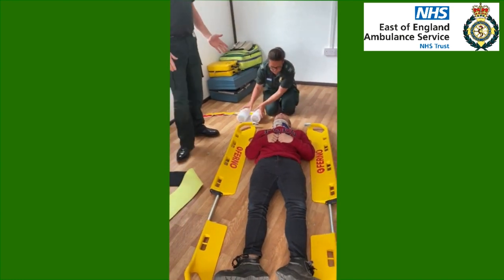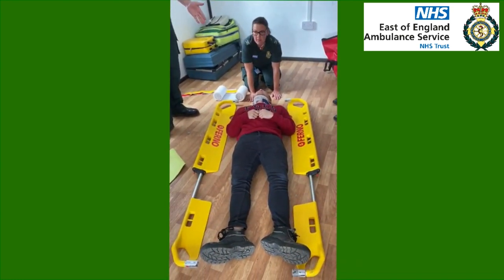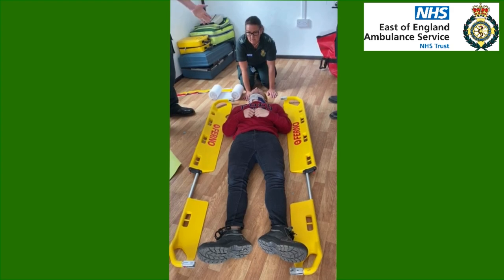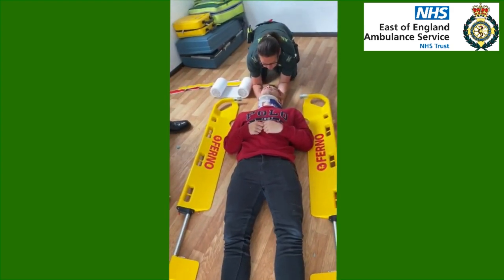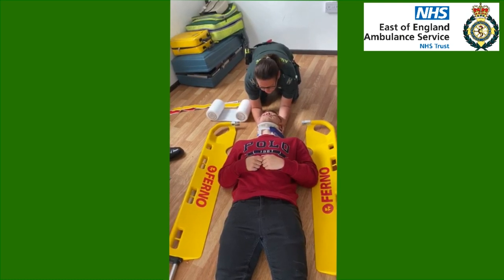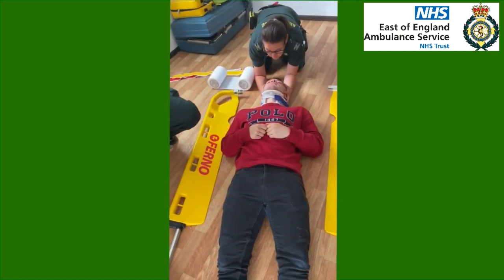What we're going to demonstrate here is the use of the headlocks and the pelvic binder in conjunction with the scoop stretcher. The patient has a collar on, so we're suspecting a C-spine injury, so Sarah if you could take C-spine please. What we're going to do team is a log roll — a 15 degree tilt — and at the same time we're going to put the pelvic binder under and the scoop under. If you could take yourself around there please guys.